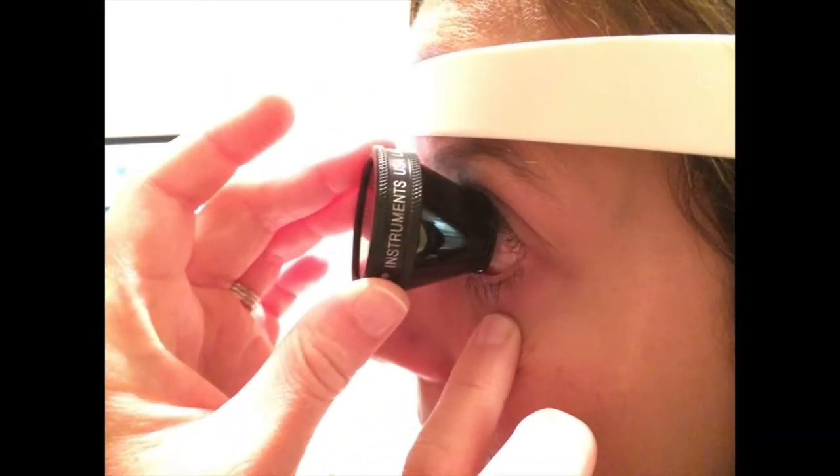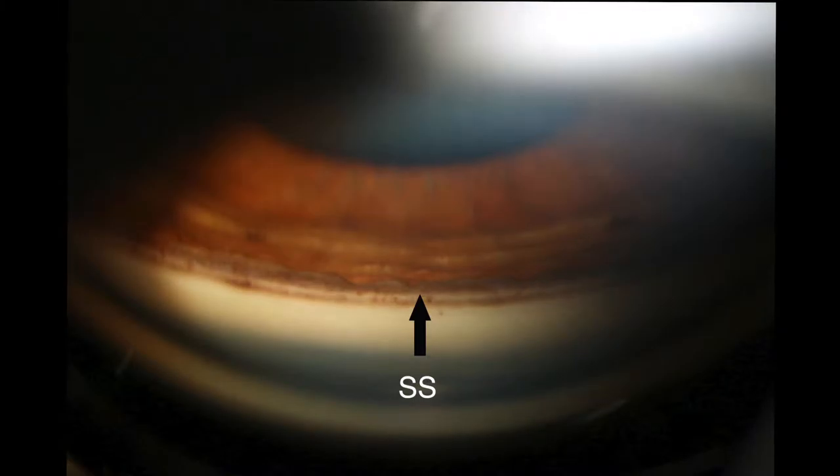The need to learn this new skill set does not replace office-based gonioscopy necessary for pre-op planning. Familiarity of angle anatomy is essential in determining a patient's surgical candidacy. The scleral spur, a white band, serves as the surgical landmark separating the trabecular meshwork anteriorly for canal-based surgery from the ciliary body band posteriorly for suprachoroid-based surgery.